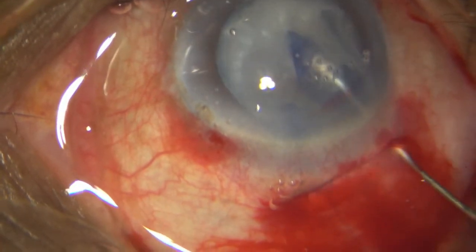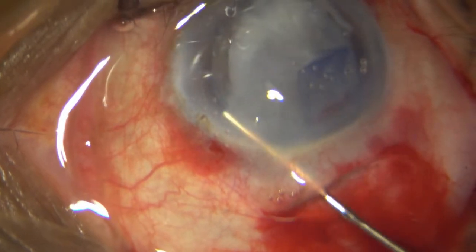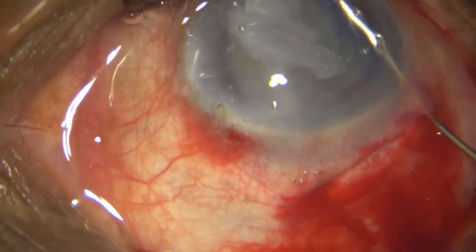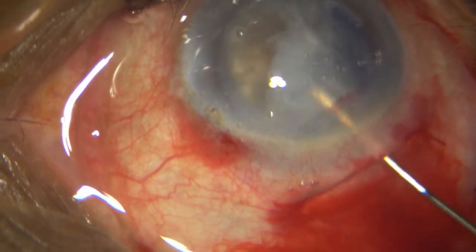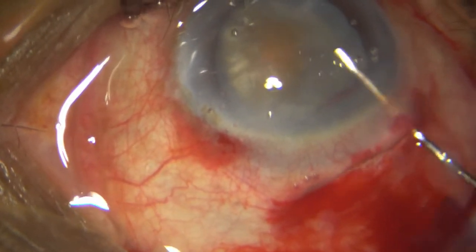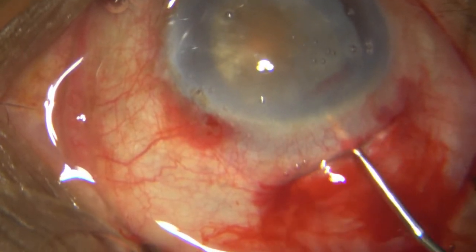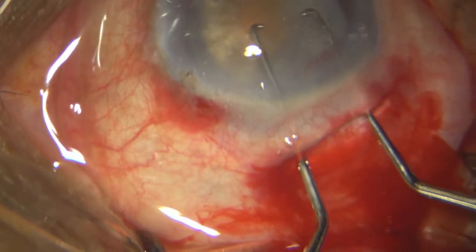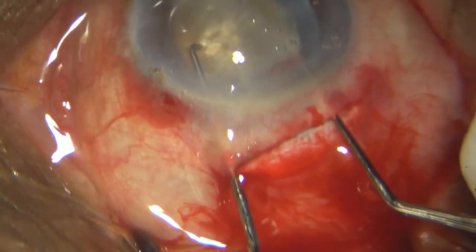I got the pole but then it went back — it is all cortex in front. Rather than going on messing around there, I jump to my alternate technique: I put in some HPMC, take two dialers, and cartwheel out this nucleus into the anterior chamber. This is a very useful technique.